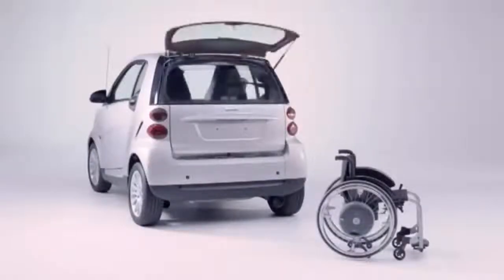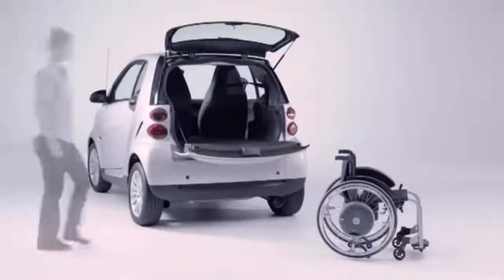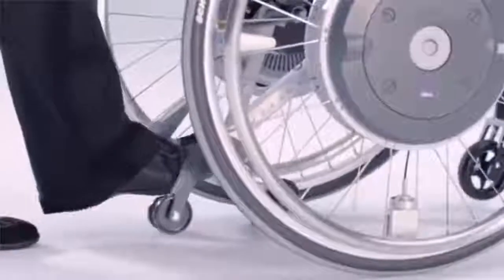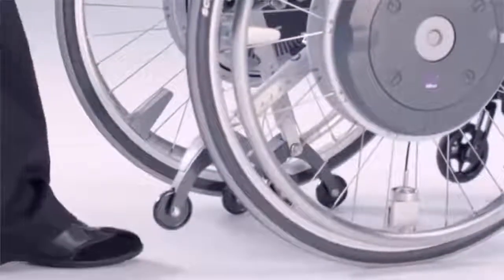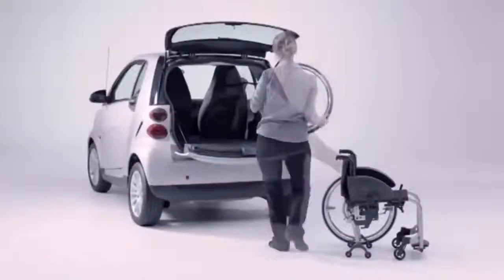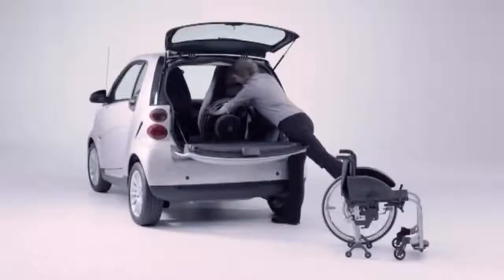E-Motion is also an ideal travelling companion. The anti-tippers even have two functions: they prevent tipping and also make it easy for you to remove the wheels. The wheels are removed via a quick release axle, making them easy to transport in the car.